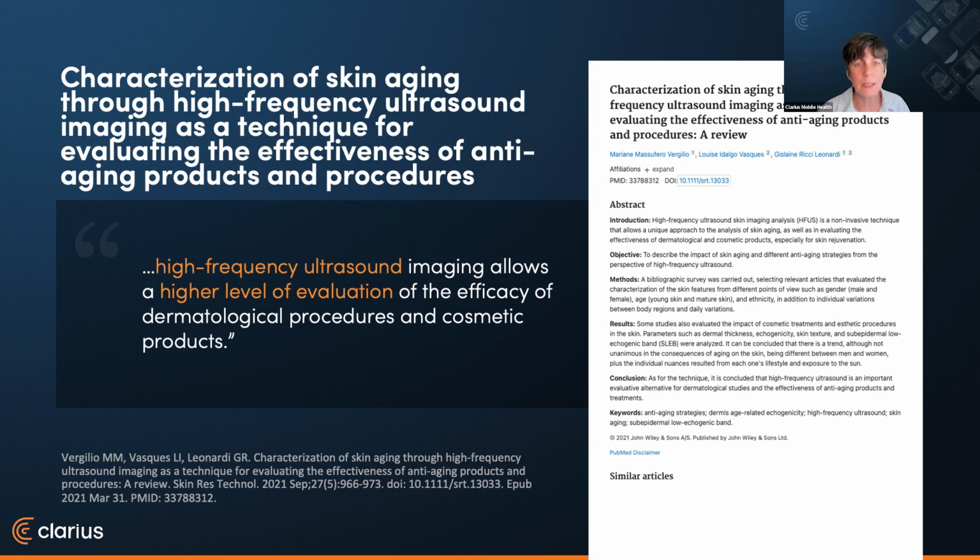And the next paper, according to the research proposed in this study from Skin Research and Technology, several skin changes caused by aging can be observed with high-frequency ultrasound. Now, dermal echogenicity on ultrasound changes with age, and also the presence and dimensions of the SLEB can be evaluated, which Dr. Ravera will discuss today. Knowing all of these things could mean better outcomes for your patients.